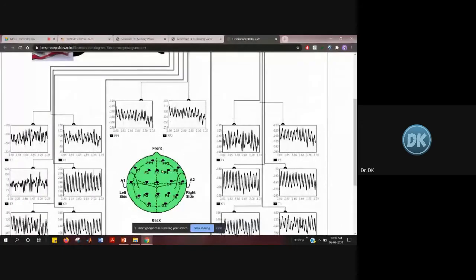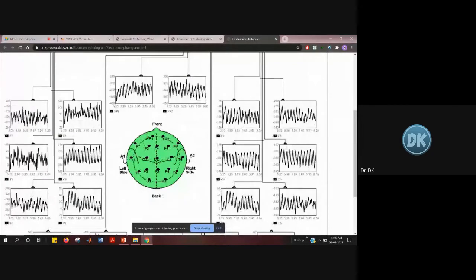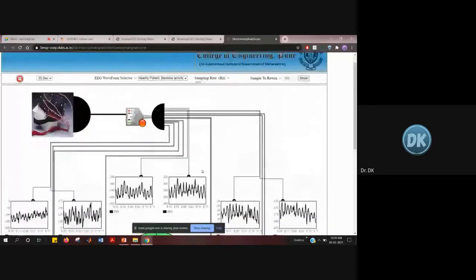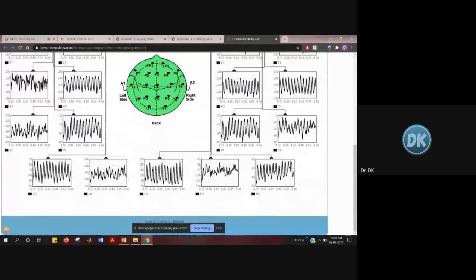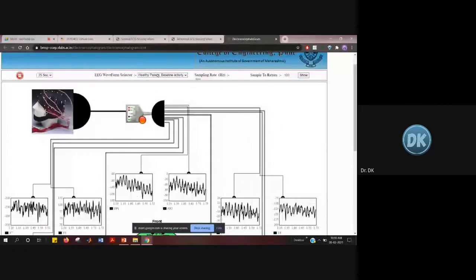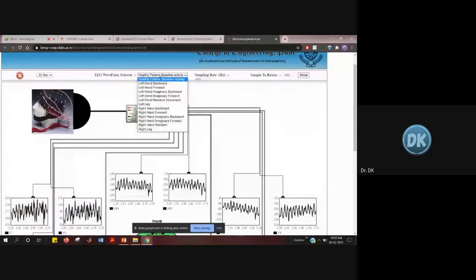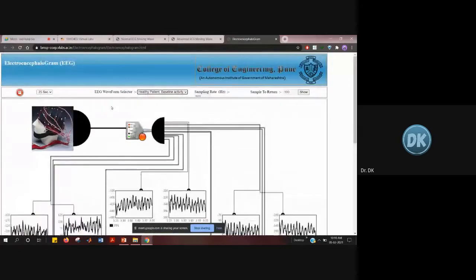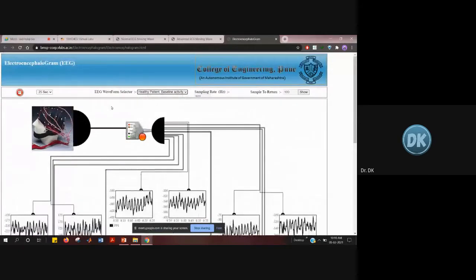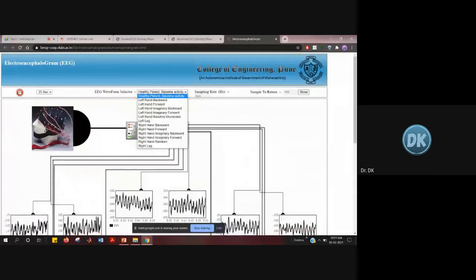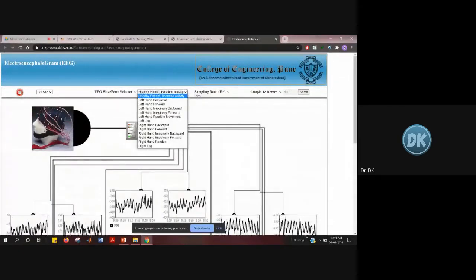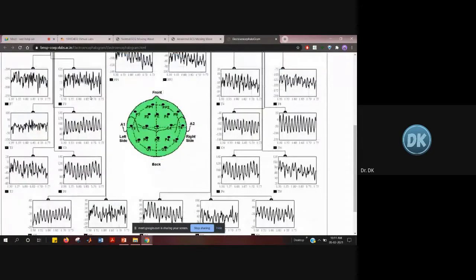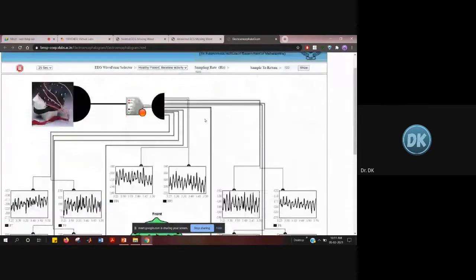The electrode positioning details will be covered in the theory part, so you don't have to worry about that. For this EEG experiment, you have to change the different conditions using the EEG waveform selector. The first waveform shown is for a healthy patient — this is what a healthy patient's EEG waveform looks like.